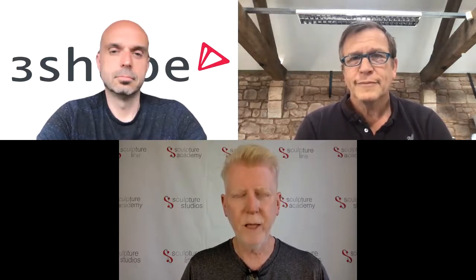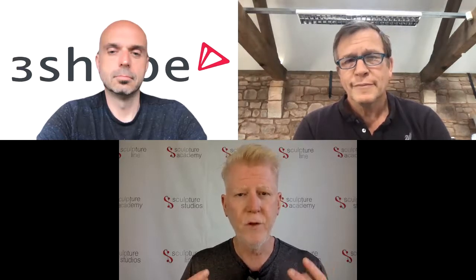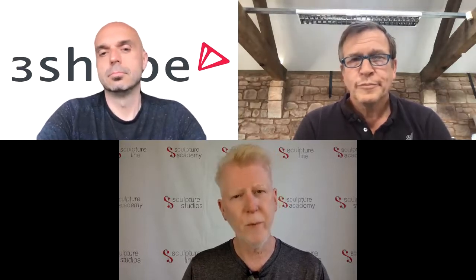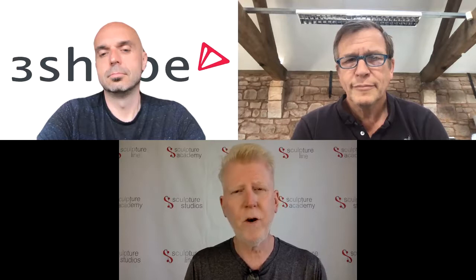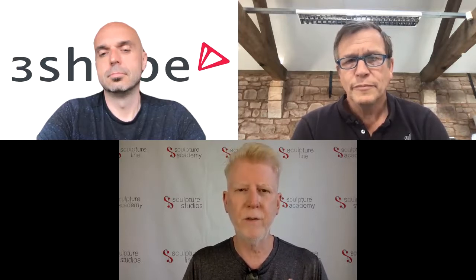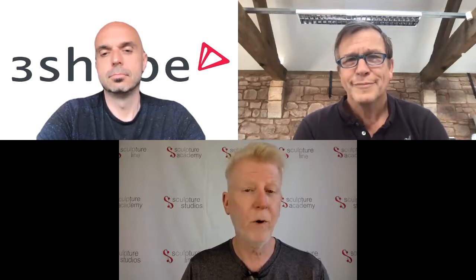But then when we get all this data, working together as a team, we're going to create a virtual patient. We're going to have jaw movements. We're going to have face. We can have a CT to even see bone. We're going to be able to put all this together, and then for us to work together on a virtual patient. A little bit farther than that, once we even get the virtual patient built, we'll be able to export that data back into a virtual reality software called IvoSmile, so the patient can actually, in virtual reality on an iPad, see very realistically what they're going to look like.